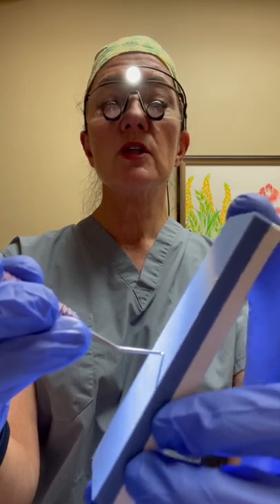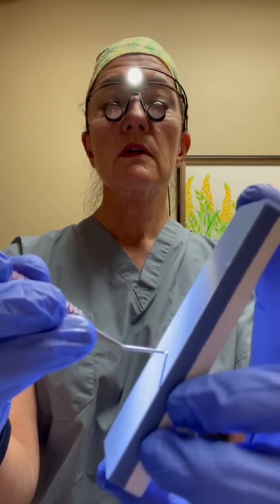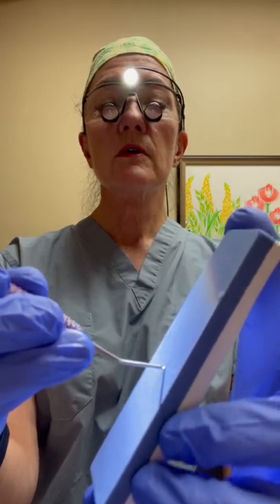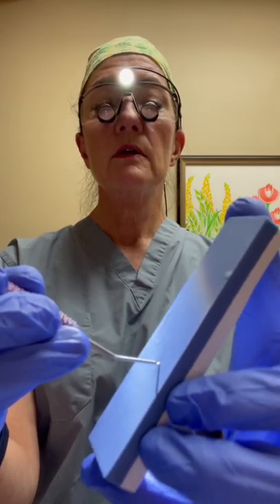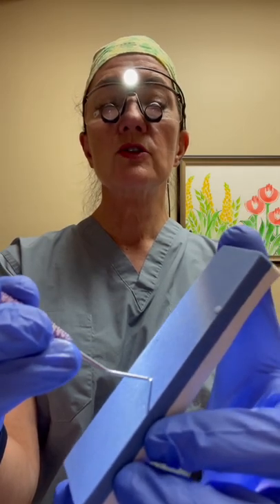Then I'm going to start sharpening. Sharpen this section until dust appears. Once dust appears, start coming around the curve. I'm coming around the curve towards my body right now, keeping the stone up against the angle of the cutting edge.